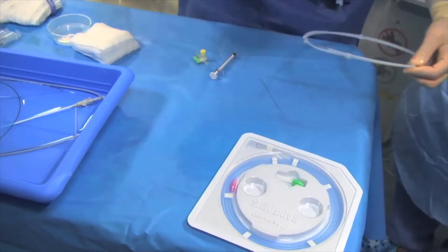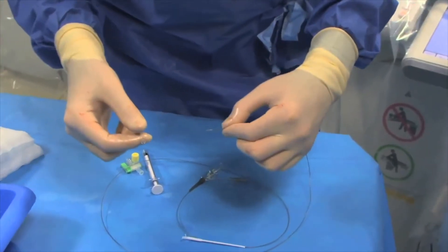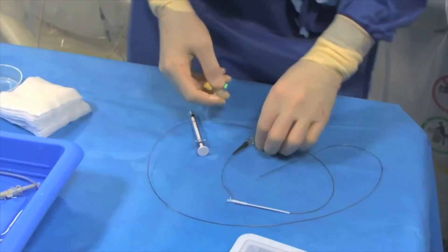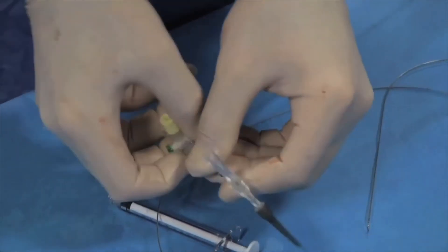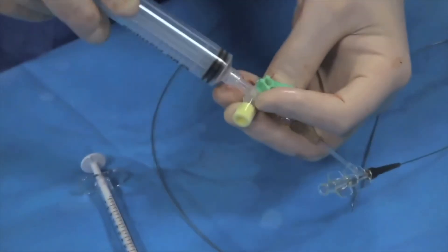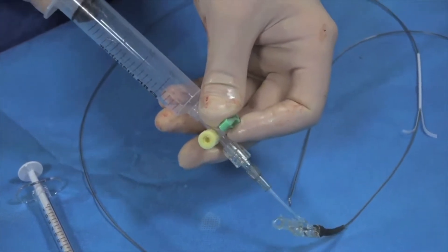We now have to prepare the micro balloon catheter for the procedure. The first step is to insert the stylet at the distal tip. The second step is to use the three-way stopcock to the balloon lumen. Then you have to use a 20cc syringe to extract the air from the dead space of the catheter.